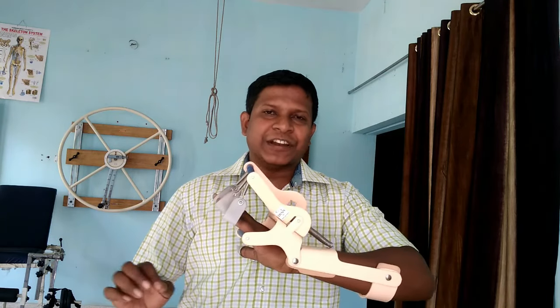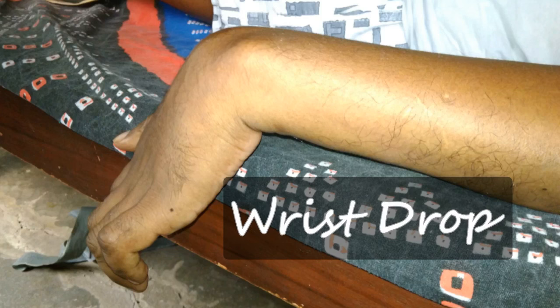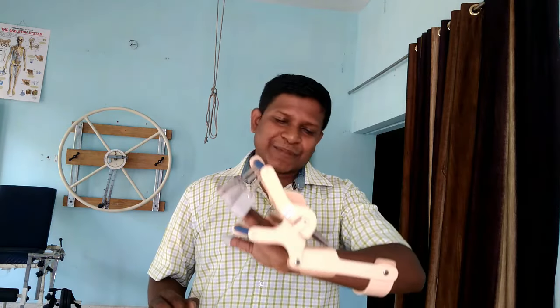This is a dynamic cock-up splint. It is used to treat wrist drop cases. At first instance it may look a bit complicated, but it is very easy to use and if used properly it can give amazing results in treating wrist drop cases. Hello friends, this is Dr. Sunit, your variable physiotherapist, and in this video we are going to see how to use a dynamic cock-up splint.